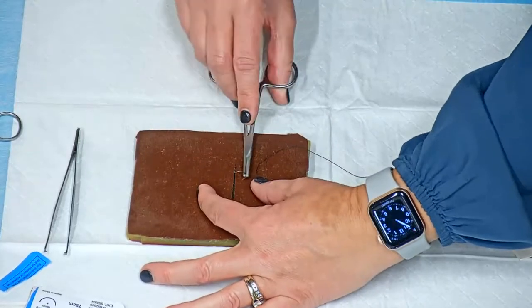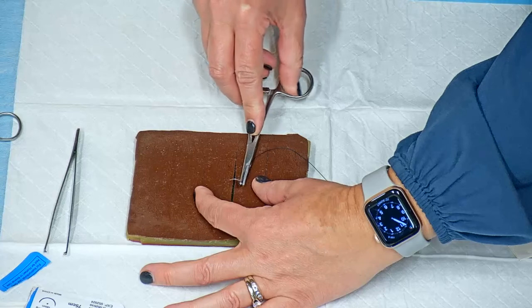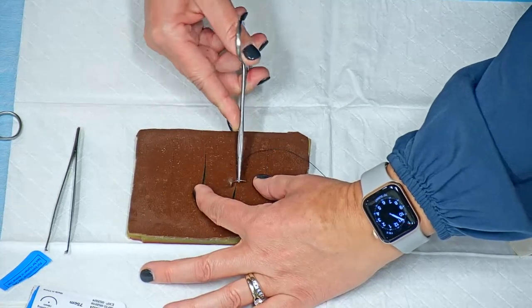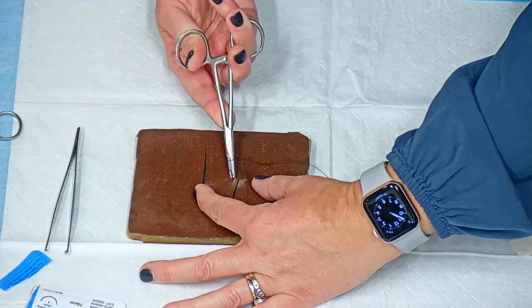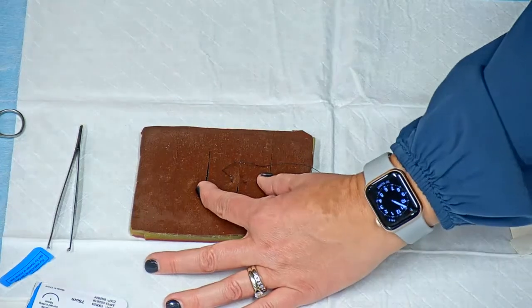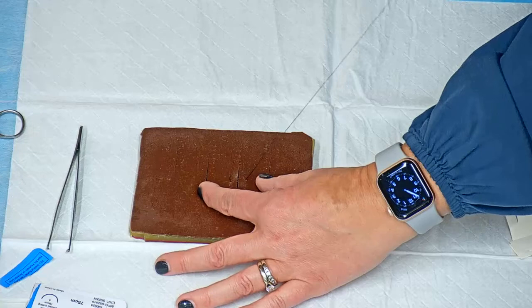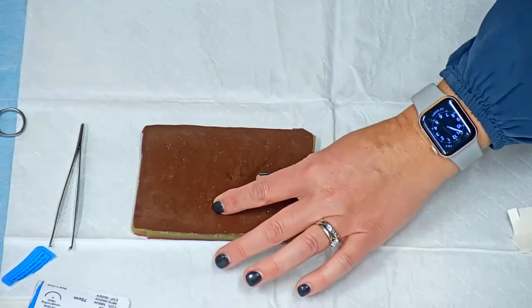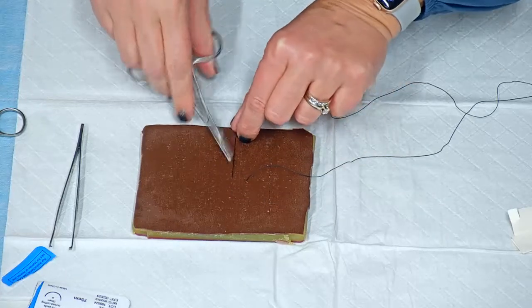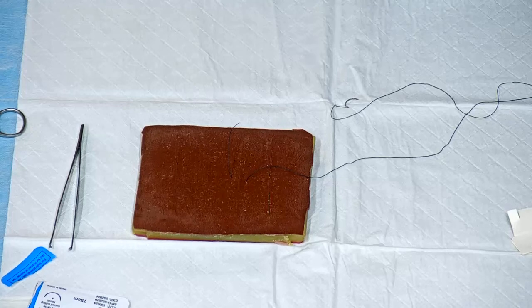So you have your hand in your correct position, about 5 millimeters lateral to the edge of the wound, and you just make this twisting motion coming out on the other side, approximately 5 millimeters. You're going to release your hemostat. Use your hemostat to pull the needle all the way through, and you want to leave somewhat of a tail. This is what we're going to use to make our knot. So I'm going to go through this somewhat slowly.